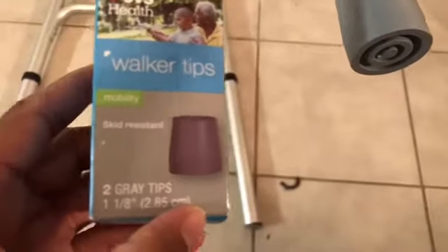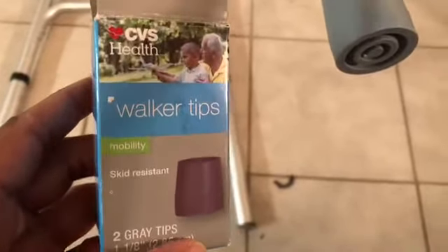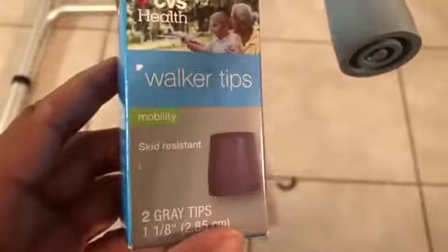So there you have it — that is how to remove and install the tips. I call them stoppers but they're called walker tips. You can get two in a box and they help with the mobility of a walker.